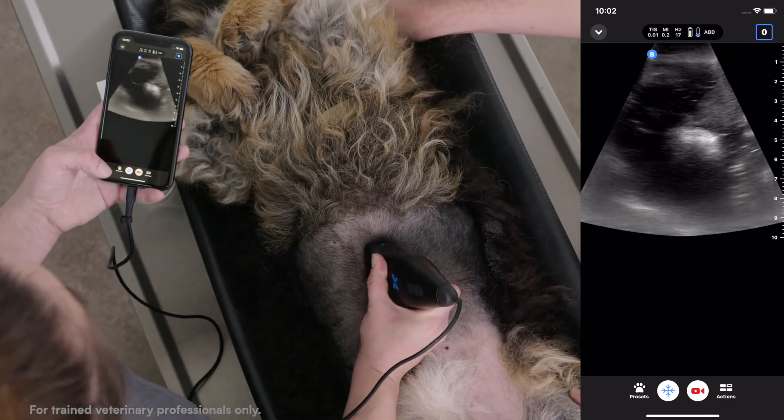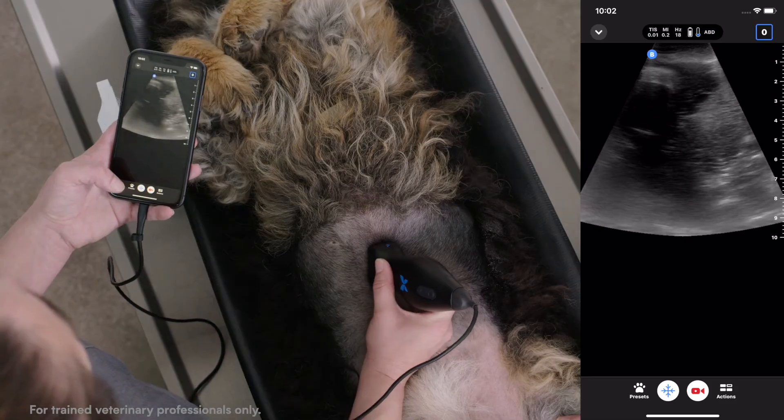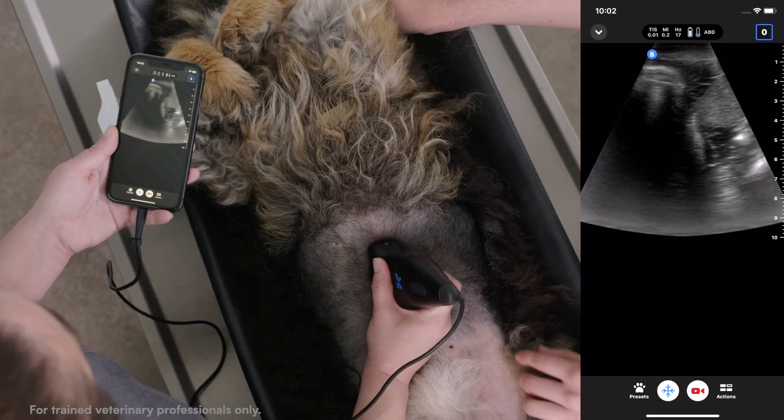You can then end by going back into the sagittal plane — and that's how you scan a liver in dorsal recumbency.